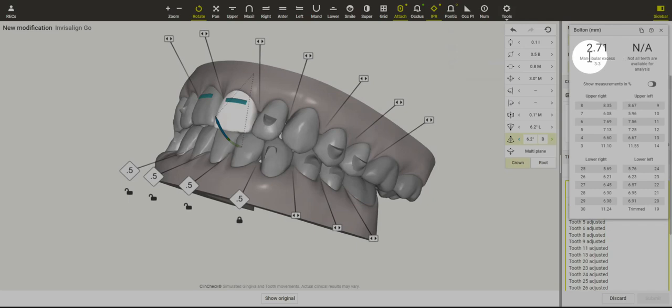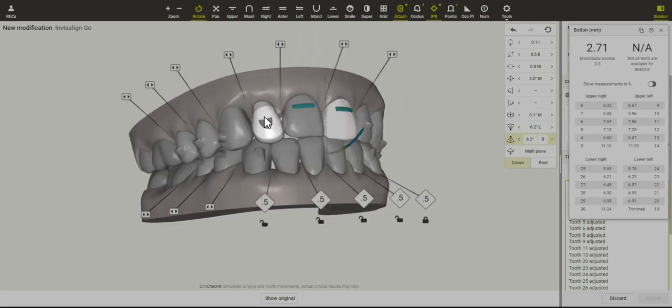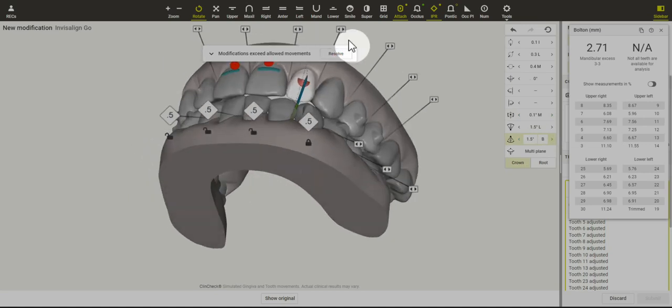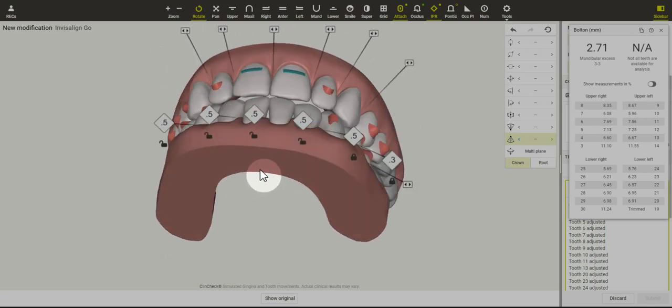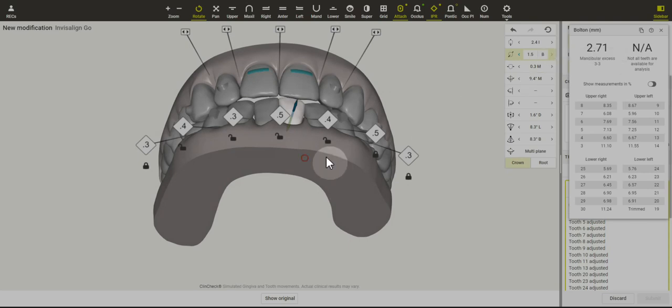Now I'm starting to think: why do we need so much IPR? Let's take a look at the Bolton analysis. What it's showing is that the lower anterior teeth are relatively bigger than the upper anterior teeth, probably because of these undersized laterals. So we could plan for spaces around the laterals and some restorations, or maybe we just add some small areas of IPR distal to the canines — not our number one choice, of course — but that does allow for this case to be more predictable.